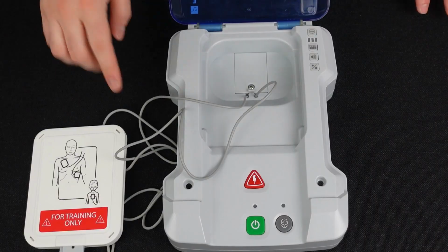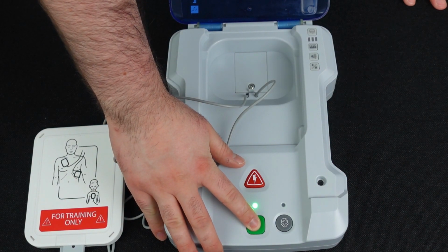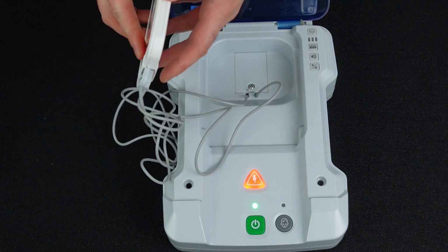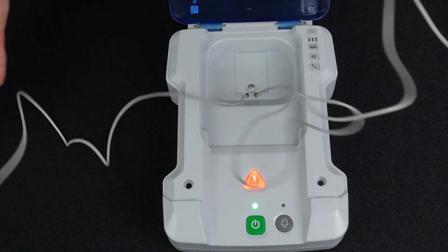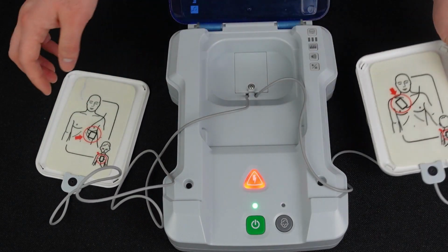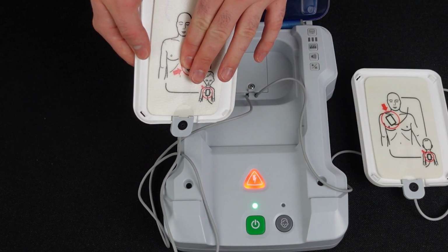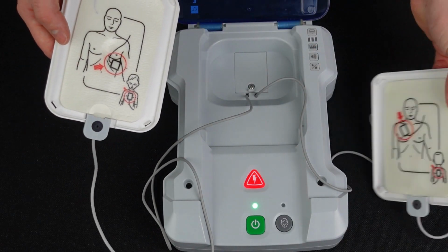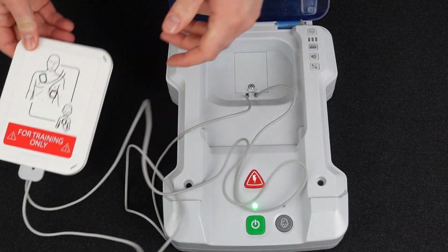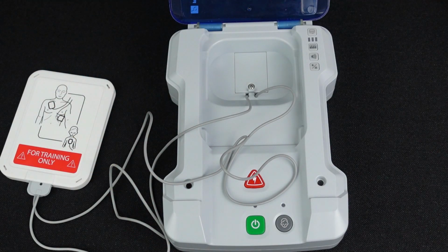To test if the AED training pads are being registered by the trainer, you will hold down the power button for about 4 seconds until the trainer beeps once and the red shock button is blinking. You can then either place the pad on a clean surface or press the center of the pad down so that the sensor touches the storage case. If the pads are being registered by the machine, then the trainer will beep. If there is no beep, then either the pads or cables need to be replaced. Press the power button to exit.